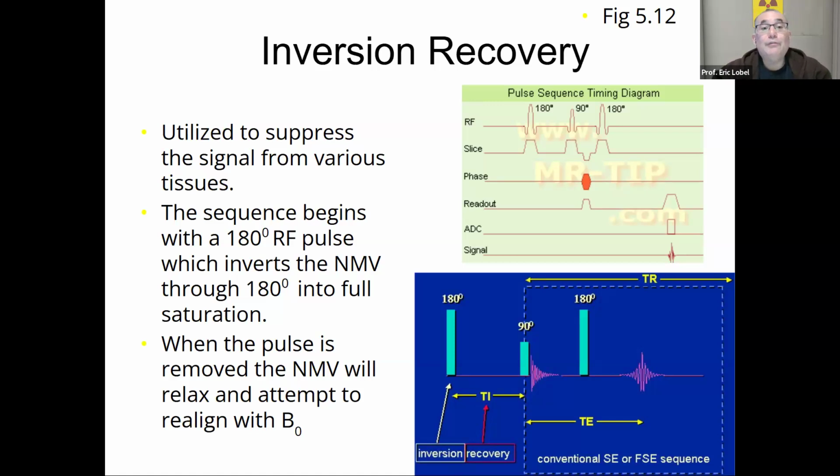So here is the rule. You must write this down. If I said that the magic number for relaxation, remember, was 63%, my magic number for this stuff is 0.69. So here's the rule.